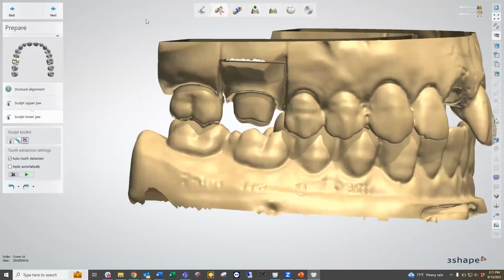So moving on to just the overall user interface of this case, we're going to be seeing the navigation panel, which is actually in the middle here. And this basically highlights the big steps that we're going to be going through. The first one being the prepare step. The second one being our segmentation or annotation step. The third one is going to be our direction step.